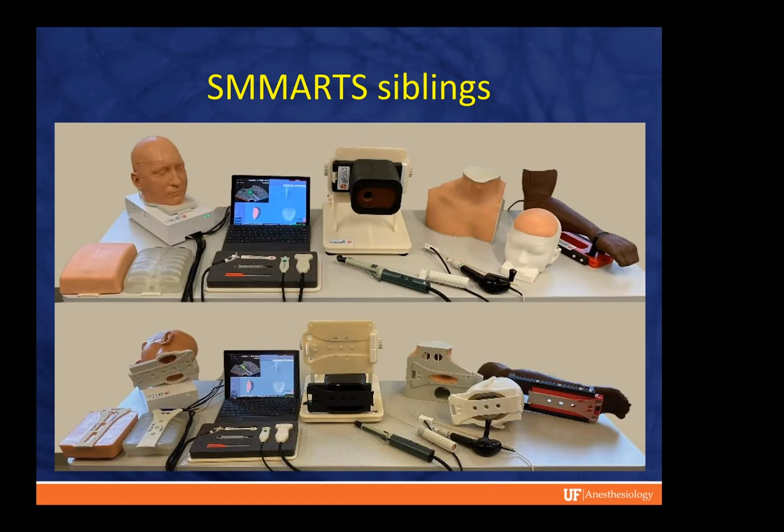So there's a whole range of tools that are available, and we can see that all of them have this same sort of pattern built into the bottom that allows them to snap into this one unit here that essentially is the tracking hardware. And then in the computer, you can see this one is what's hooked up now is the prostate trainer. So you can get a virtual ultrasound image and you can see a 3D representation of the prostate and how a needle interacts with the prostate.